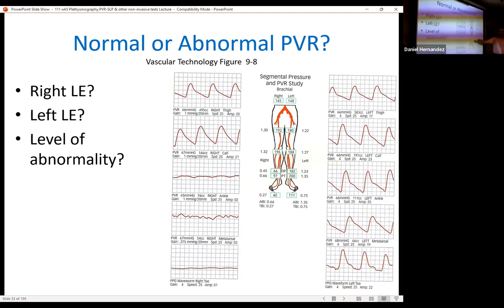It could be in that area, the knee. But you are getting a pressure at the knee, right? Yes, you're getting a pressure at the knee, which is 132 or 196. I guess you wouldn't be able to tell that on there. So it has to be below that sensor; it's still getting good waveforms there, even though they're losing it a little bit. So most likely it's the calf, your calf basically.